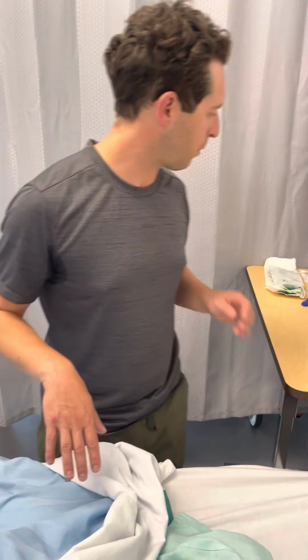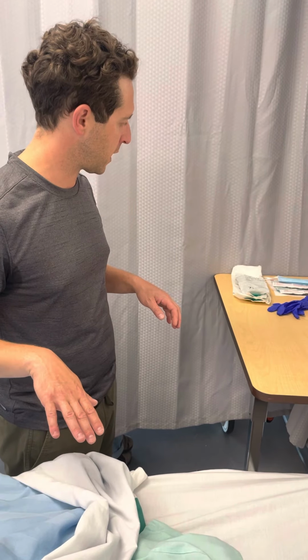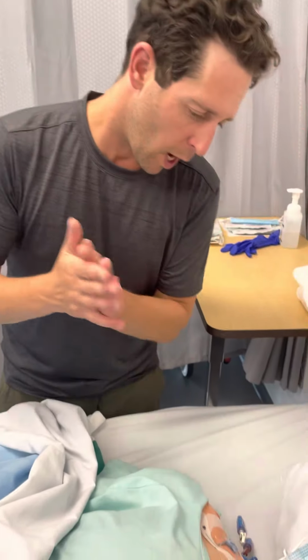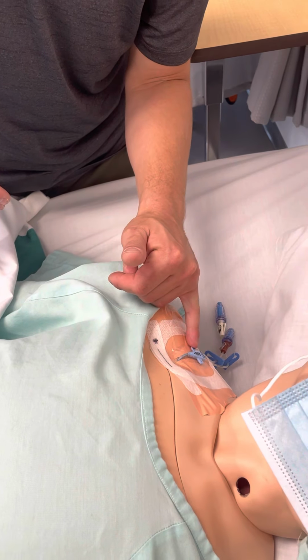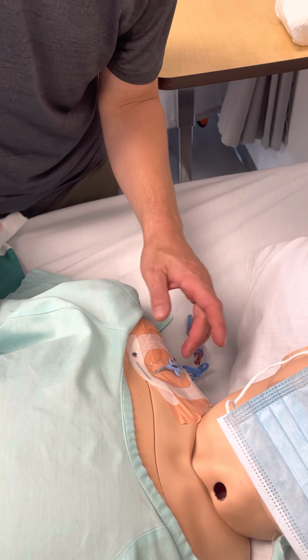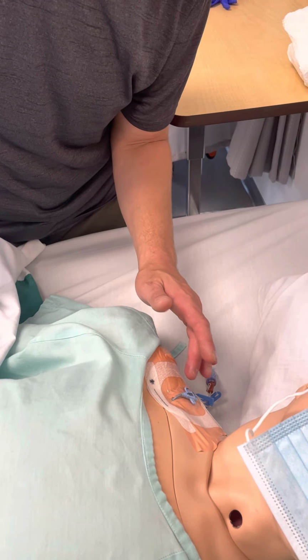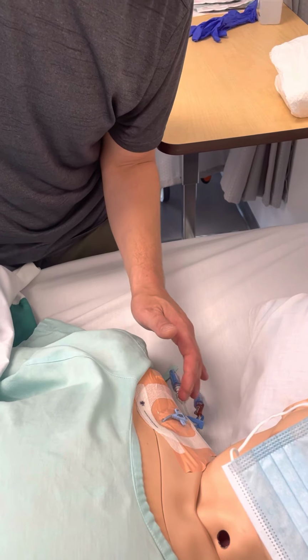Okay, so Pat, I'm going to start my assessment now just on your CVAD dressing there. I'm going to wash my hands one more time. I see that it is needing to be changed today. It's been 7 days. As I mentioned, there's a suture in place. The caps are secure. The clamps are in situ. The dressing's not leaking. It's not bleeding. There's no signs of swelling or infection. Pat, do you have any pain? And I palpate. No pain.